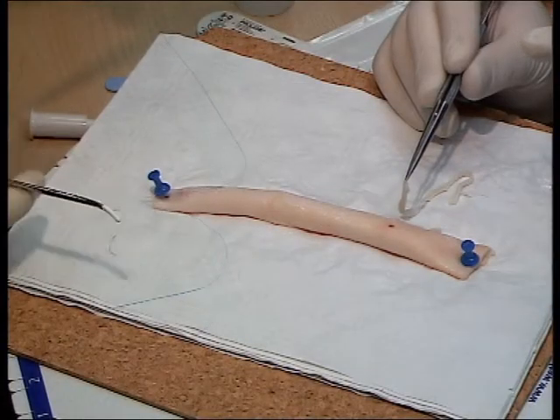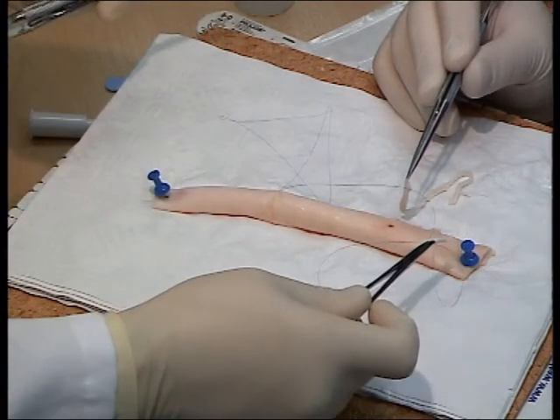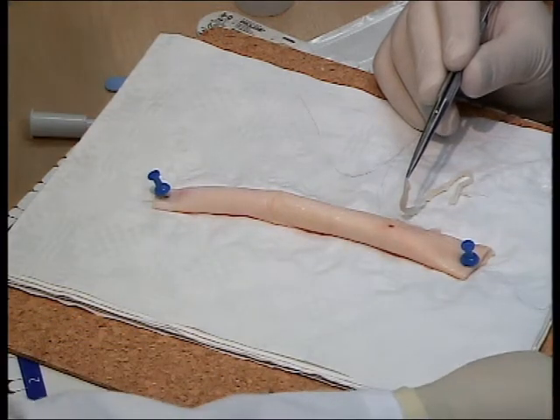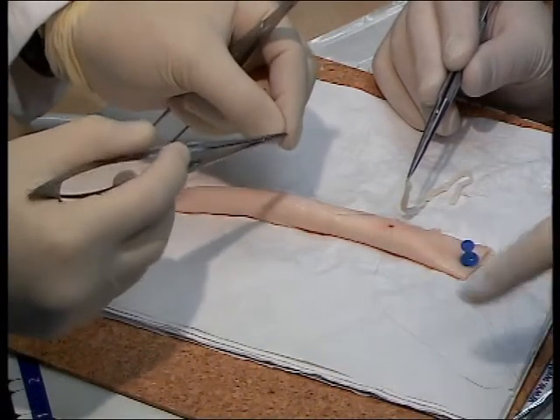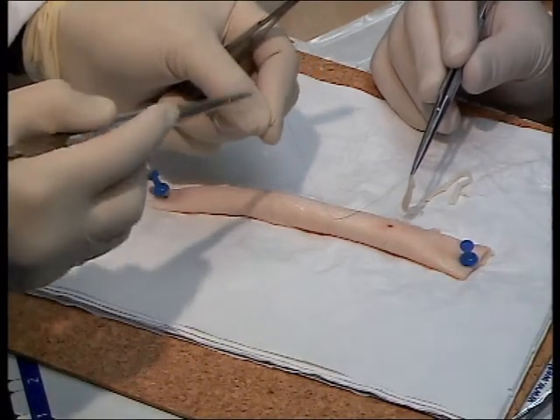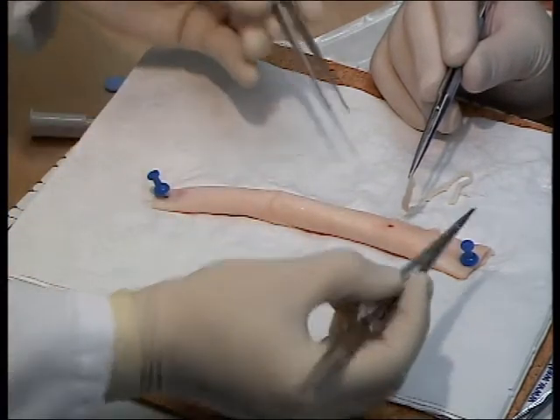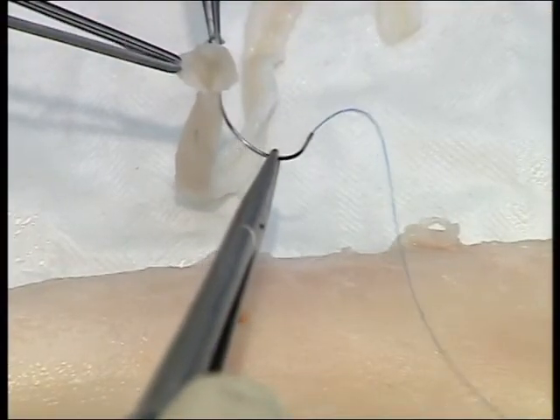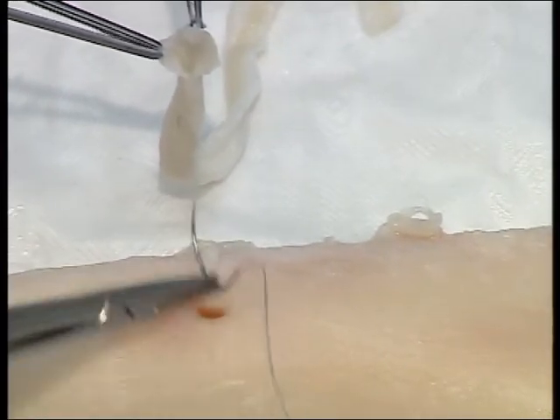Using a 5-0 Prolene, weight one end of the suture with a shod artery forceps and put to one side. You need to consider the spacing of your sutures to ensure that the heel of the conduit lines up with the appropriate part of the anastomosis.